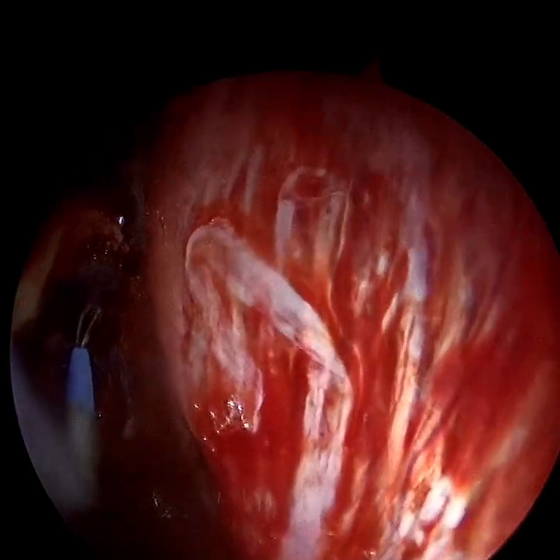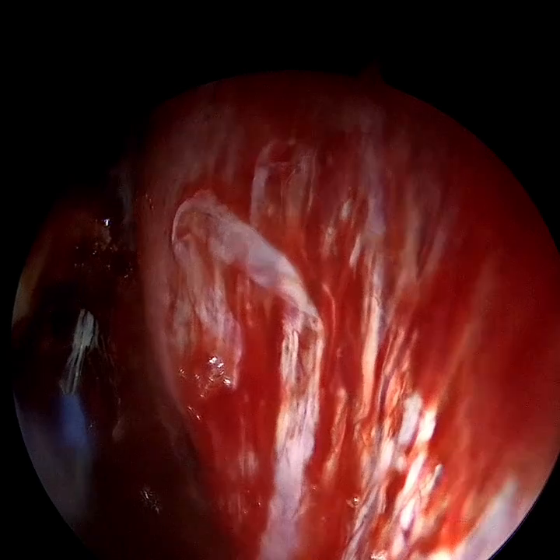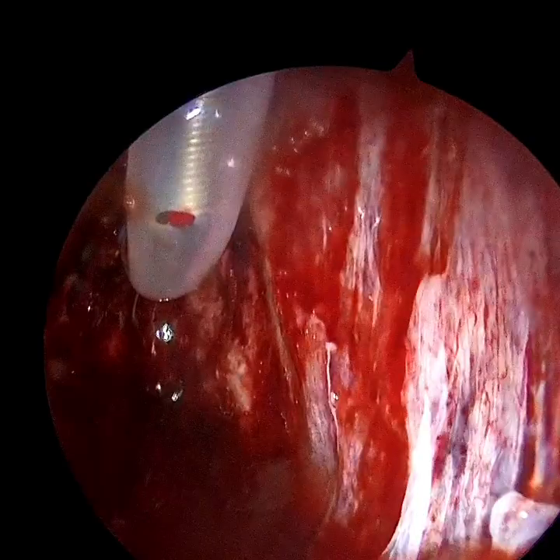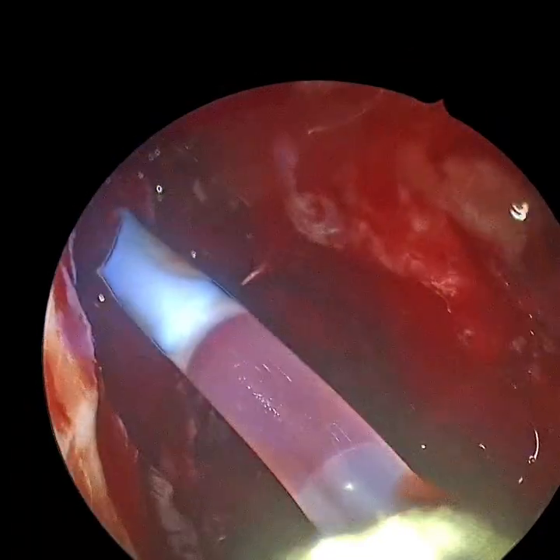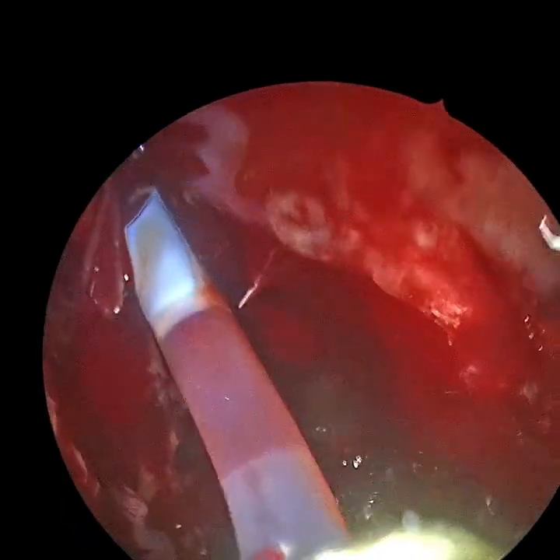So with the 70 degree scope, we are right into the frontal sinus, and then we place the stent here, and these stents will keep on releasing medications and keep this area pretty patent, and also keep the patient disease free for quite a number of times.